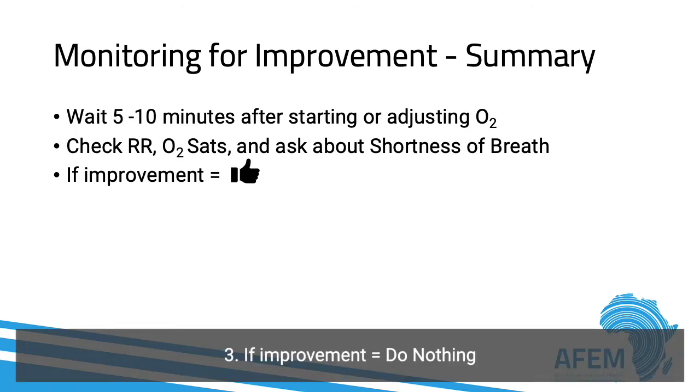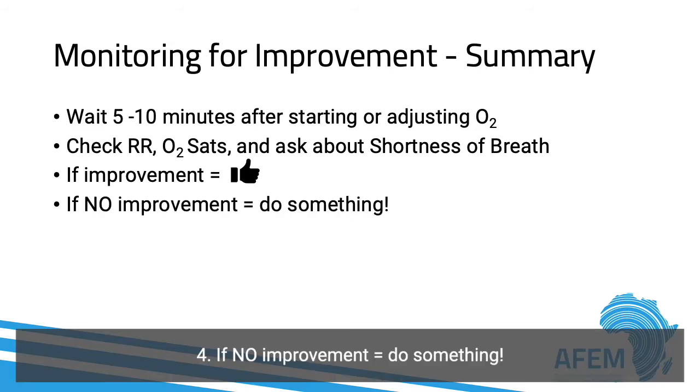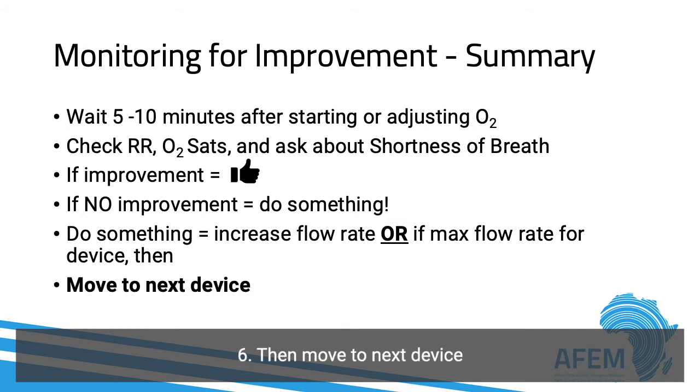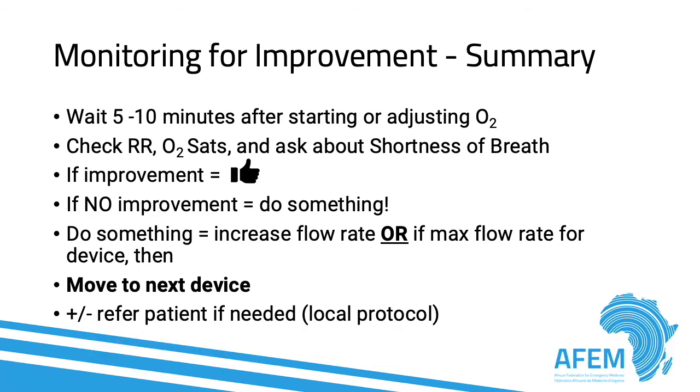Continue to monitor the patient at regular intervals. If there's no improvement, do something. You can do something by increasing the flow rate, or if the max flow rate for the device is already there, then move to the next device. You can also refer the patient if needed, according to local protocol.